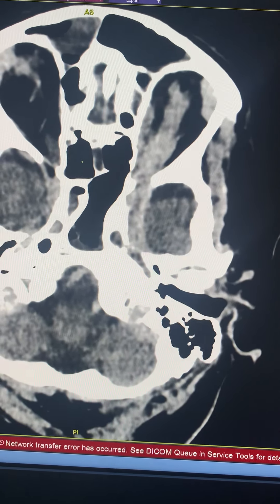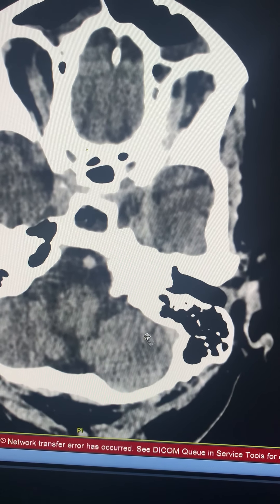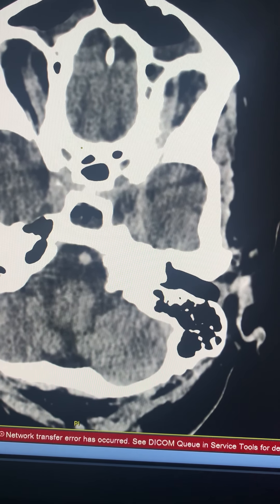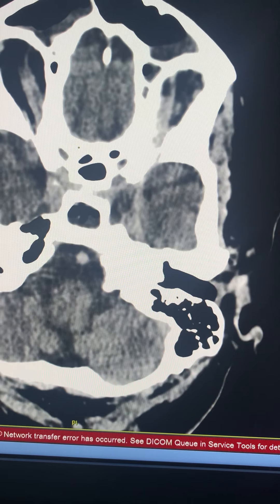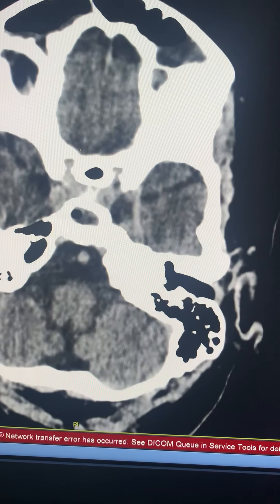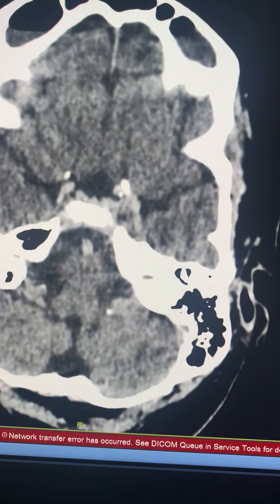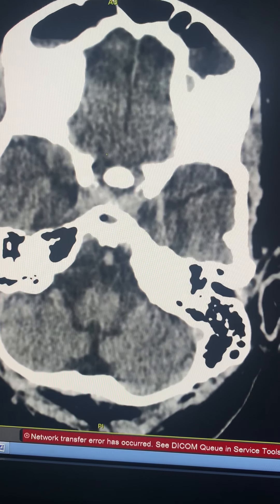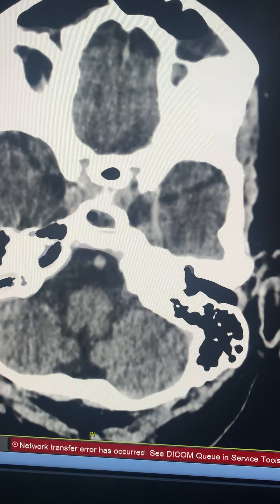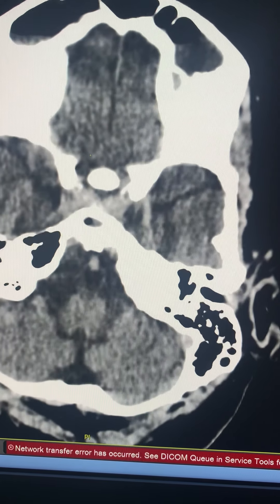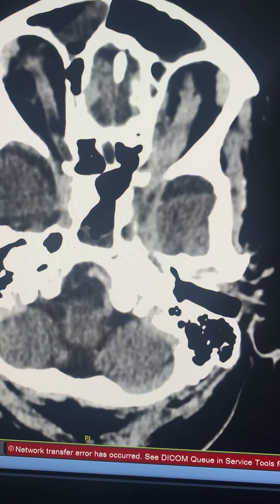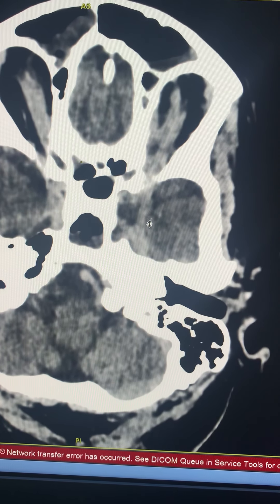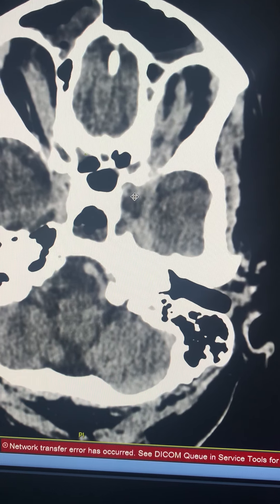Similarly, soft tissue is seen extending into the left cavernous sinus with some filling defects within. Going further cranially to look at the internal carotid arteries, there is a filling defect in the left ICA.